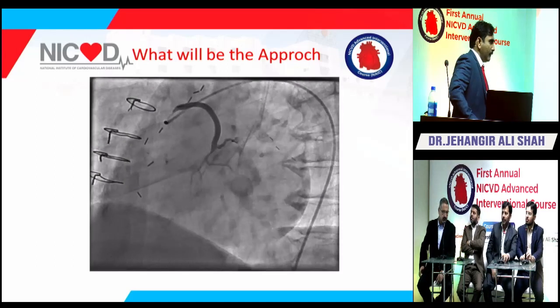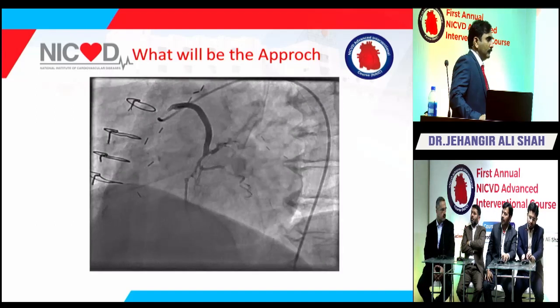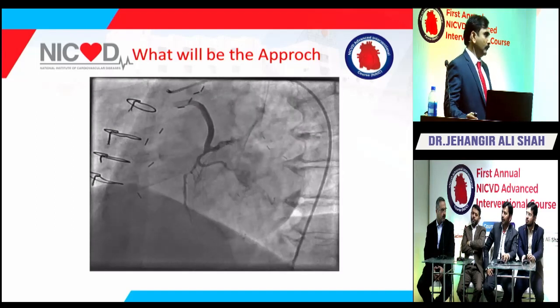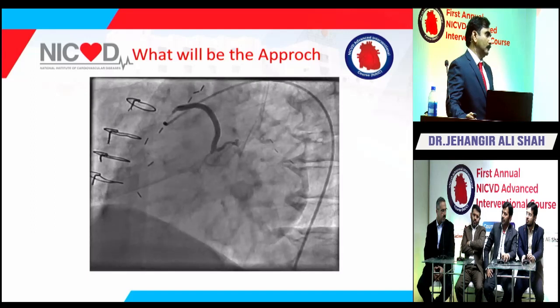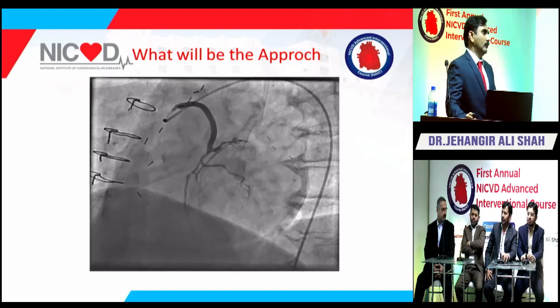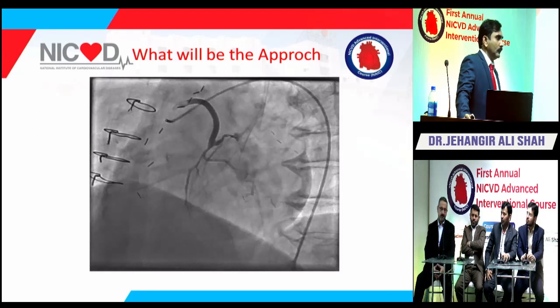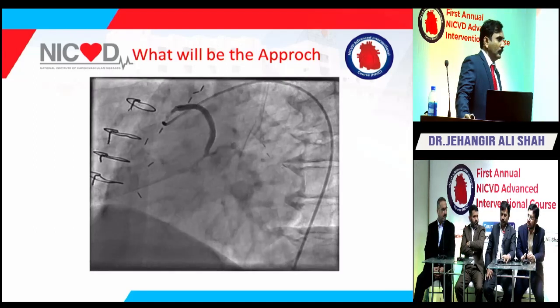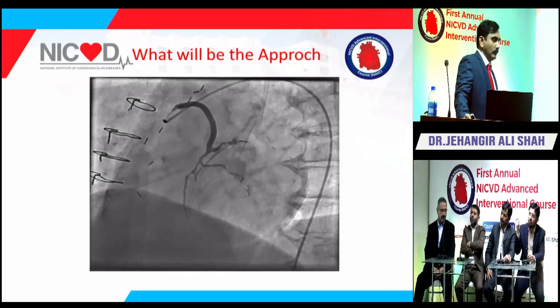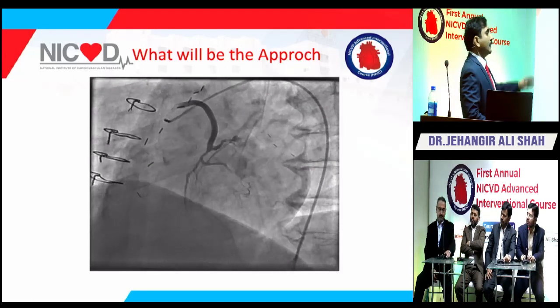It's important because in aorto-ostial lesions, in this patient it looks like a stable plaque, but there is a possibility of intervention in these cases. Or if this lesion is thrombotic, then the possibility of thromboembolism and stroke is more common. Another thing which I think should be done is that before engaging the guider, we should have a wire and a pre-dilating balloon inside the guider, because the pressure will damp and we will have little time to intervene. Yes, that's called the hit and run technique.